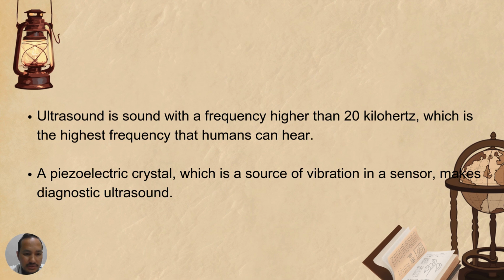A piezoelectric crystal, which is a source of vibration, is in the sensor that makes diagnostic ultrasound. And then one more thing: there are three principles related to attenuation. First, absorption, second, reflection, and third, refraction.